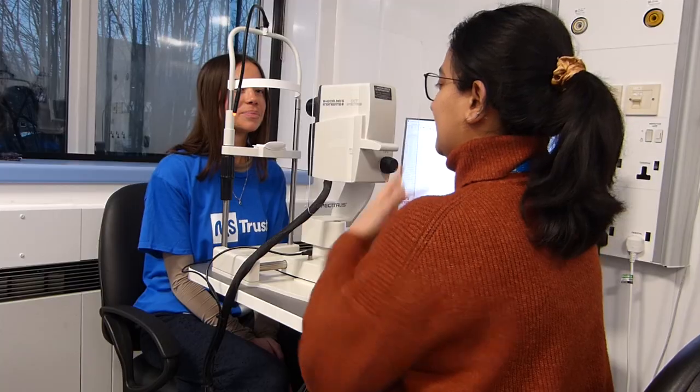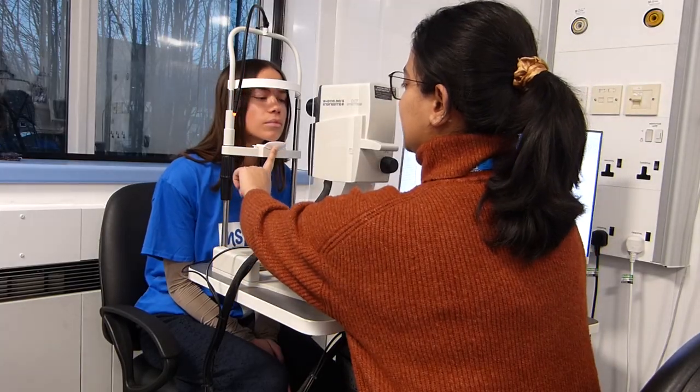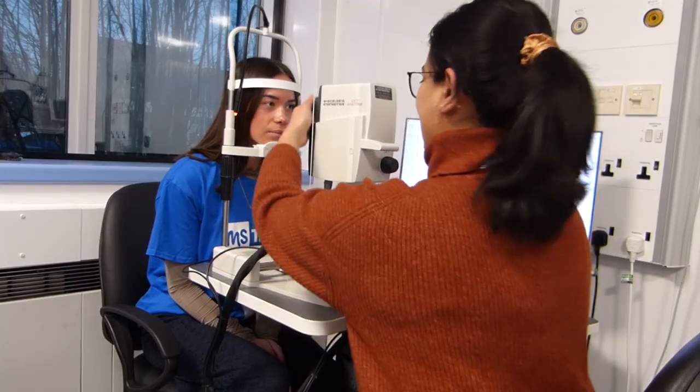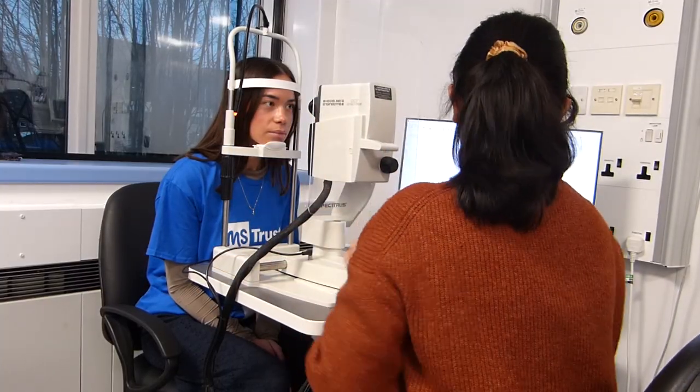So as part of the diagnosis of MS, some people may be invited to have an OCT test because it allows us to measure whether or not MS has affected one of their eyes. And we can do that by doing the test, which takes about 5 minutes at the most, and comparing the structure of the nerve fibers between the left and the right.